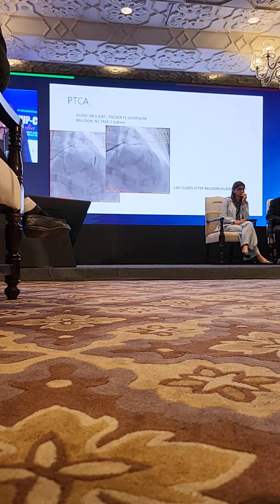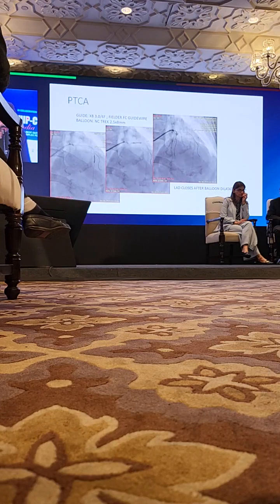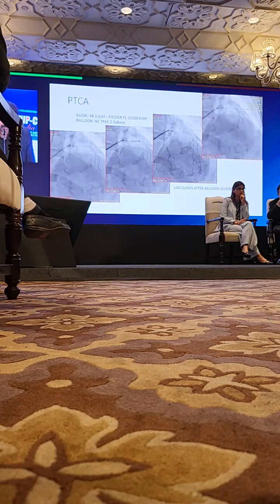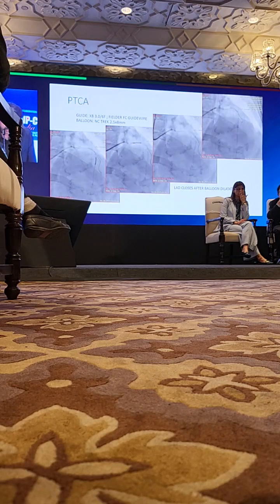So after I did this dilatation of the diagonal, the patient had no flow of LAD. So probably after the LAD there was some dissection flap which had closed, after which the LAD closed.